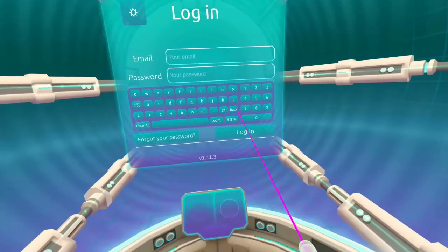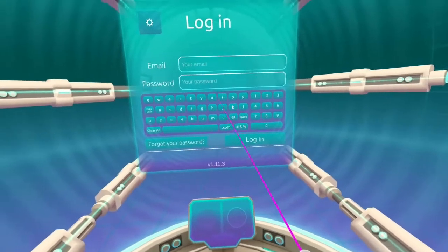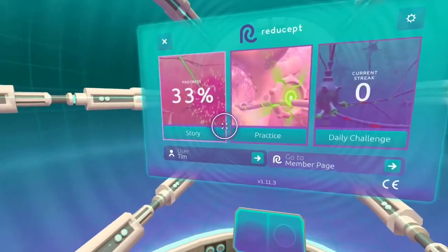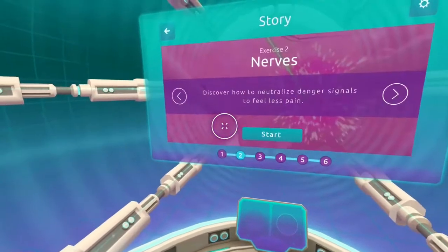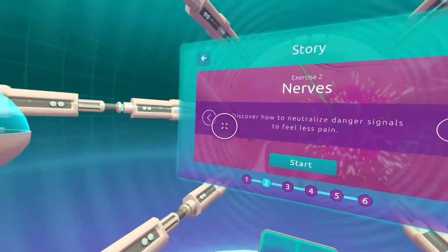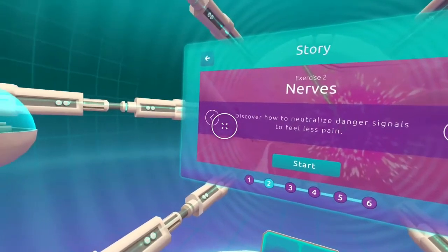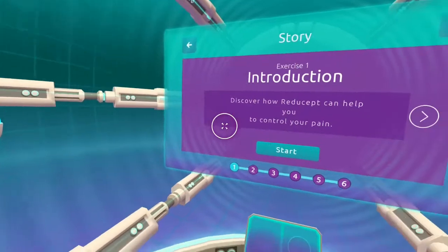After a user logs in, they are met with the menu page, where they can choose to continue where they left off in story mode, practice a level they already know, or maintain their streak by partaking in the daily challenge.